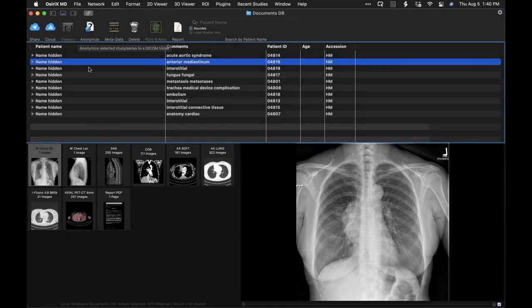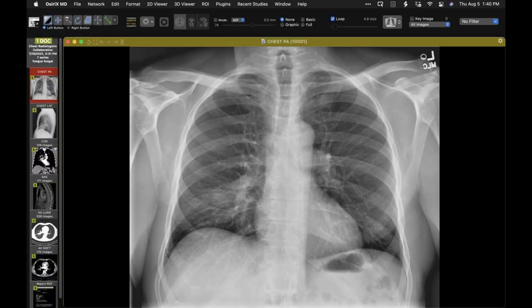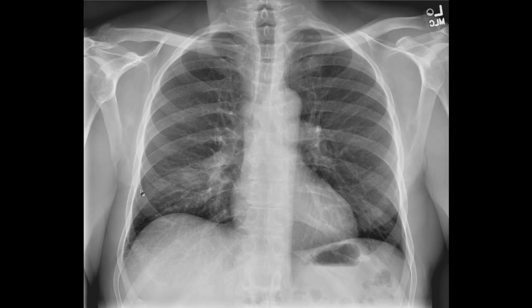Let me show you this one, really interesting. So I came across this radiograph, and I'll show you in a moment the history, which was of a respiratory illness, but it didn't seem severe. And I'll bring up the lateral projection. So there is ill-defined opacity in the right lower lobe. And of course, I wasn't certain whether associated with it was potentially some regional lymph node enlargement.